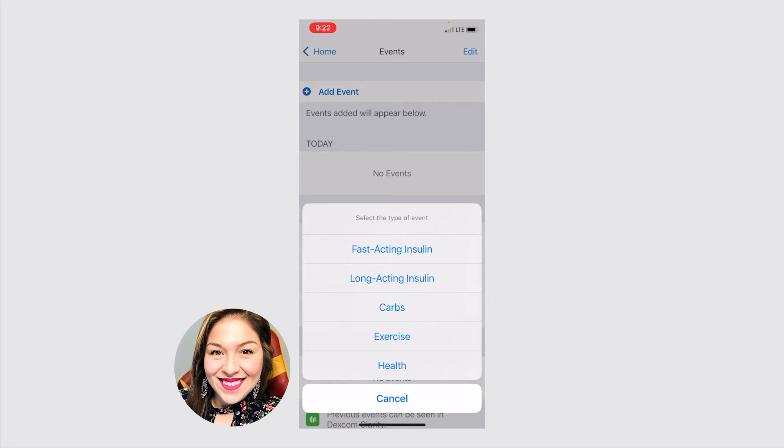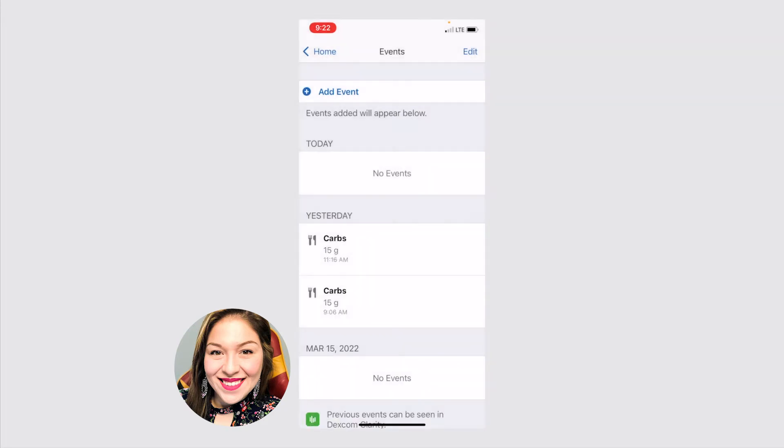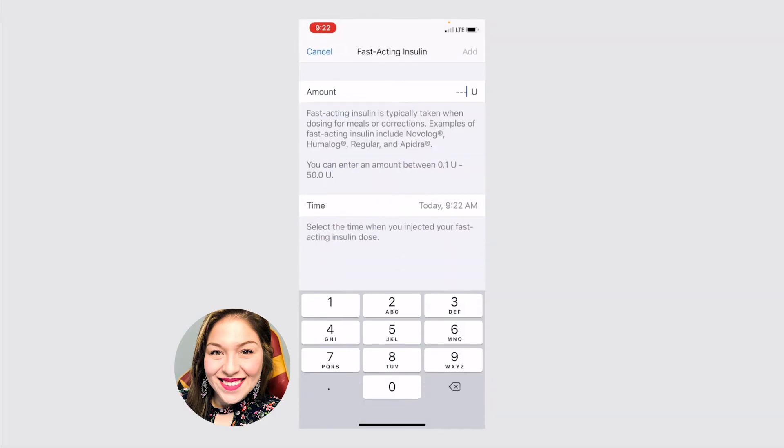There's fast acting insulin, and then long acting insulin. If you don't know which one you're using, you should ask your doctor. But there are some helpful tips. If you click on one, for the fast acting insulin, it tells you here, it's typically taken when dosing for meals or corrections. And here are some examples of fast acting insulin.